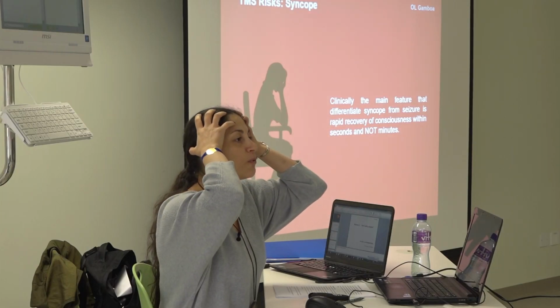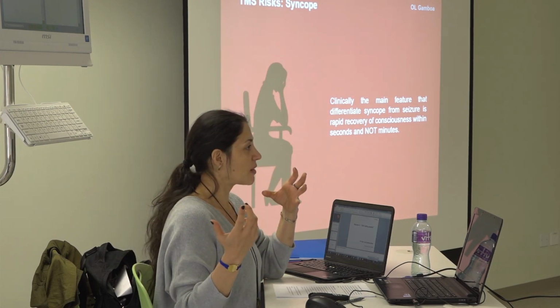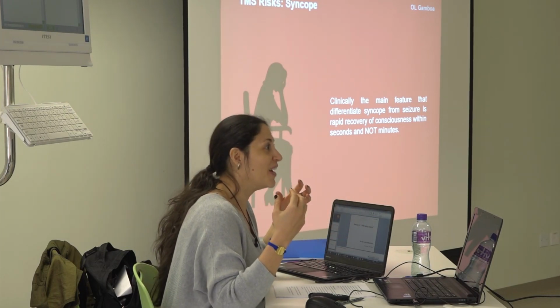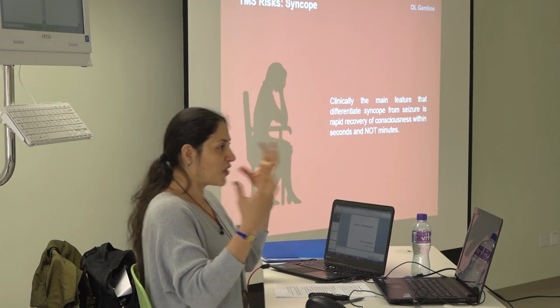When you have experience with TMS, you can actually feel it in the head. If you are holding the head of the person, you feel that the person has a loss of tone when the syncope is happening. You feel it's different. My experience is that the boys normally will not tell until you ask them. Are you fine? No, I'm not fine, because you can feel it. You can feel that the person is not there anymore. The tone of the body is not there anymore.